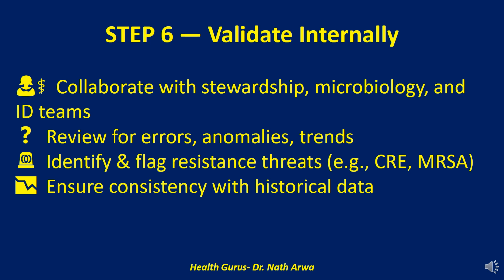Now dig into the details. Review for typos, formula errors, and statistical outliers. Does something seem off? A 100% susceptibility to vancomycin for Escherichia coli. That's not just unusual, it's impossible. Look for weird trends, unexplained jumps, or dips that don't match clinical expectations.